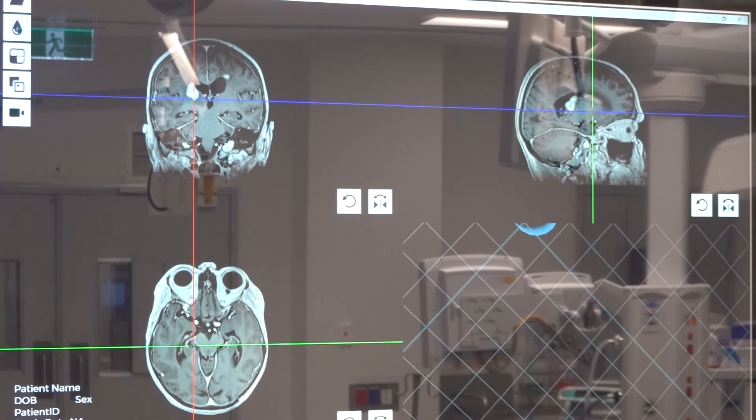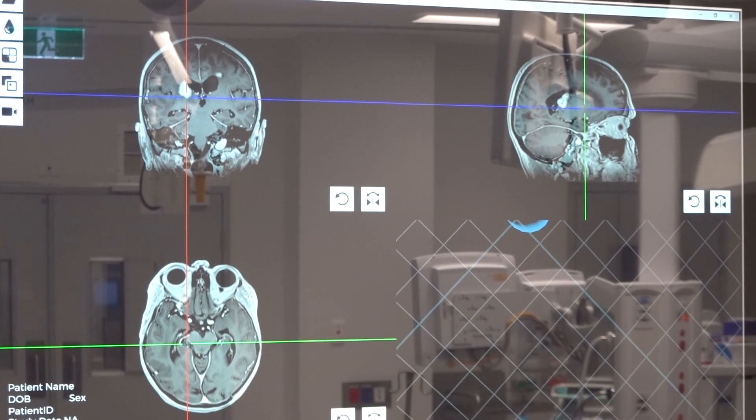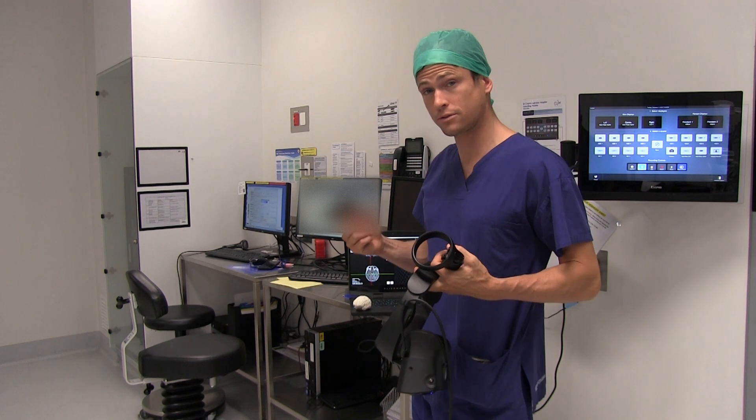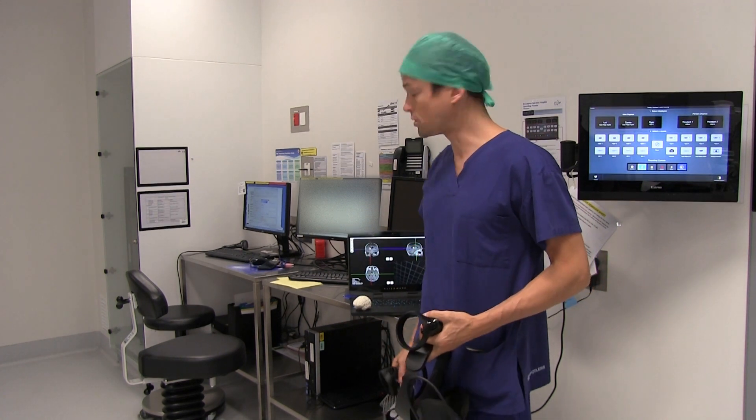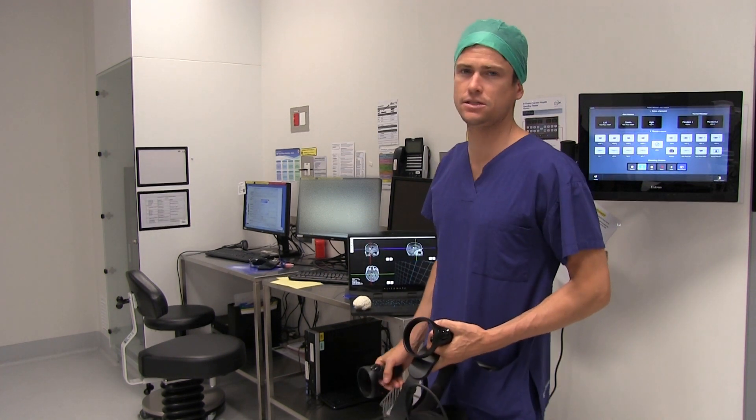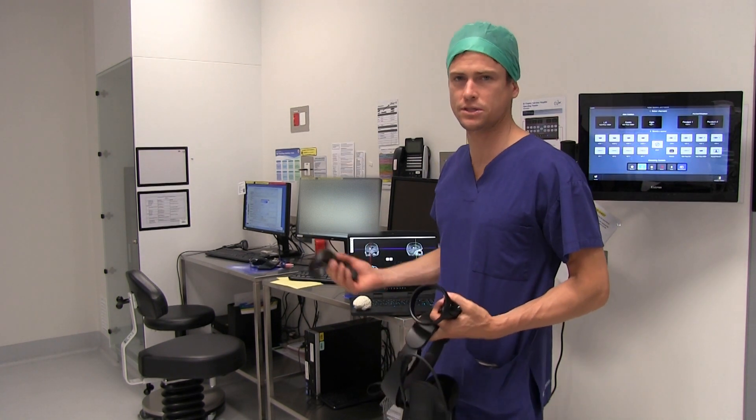MedVR's system consists of a headset, a computer and controllers, and once you load the data it's really easy to engage with the scans.